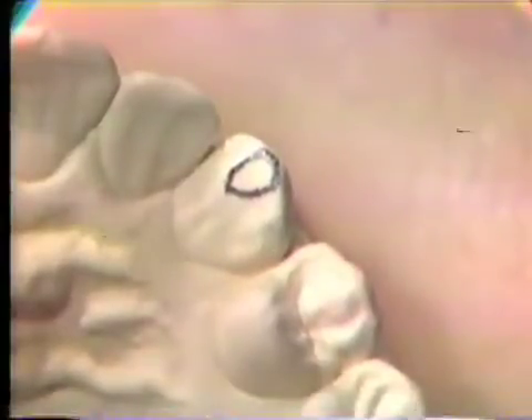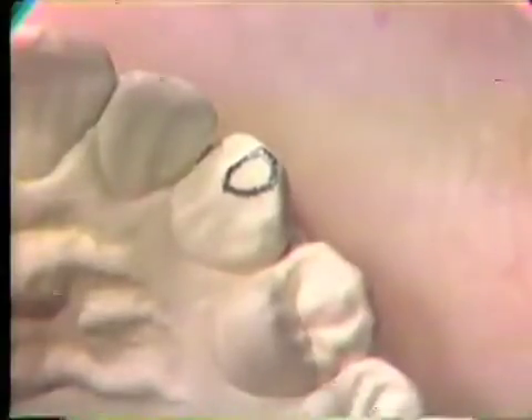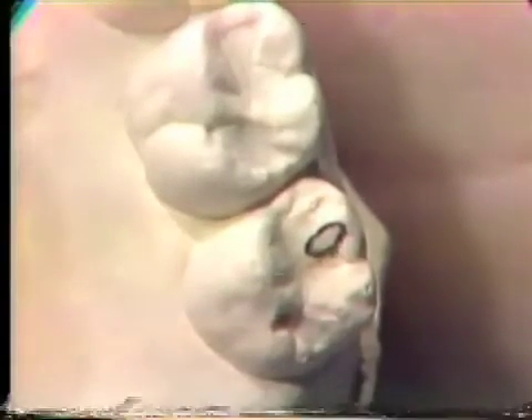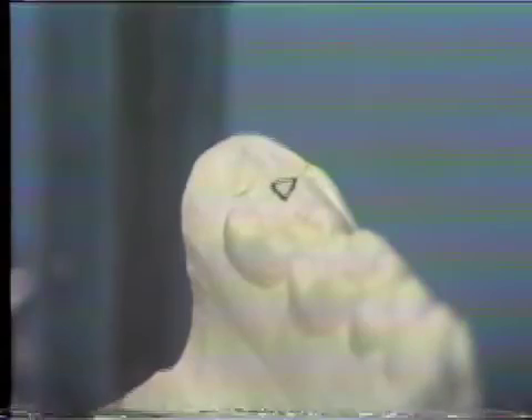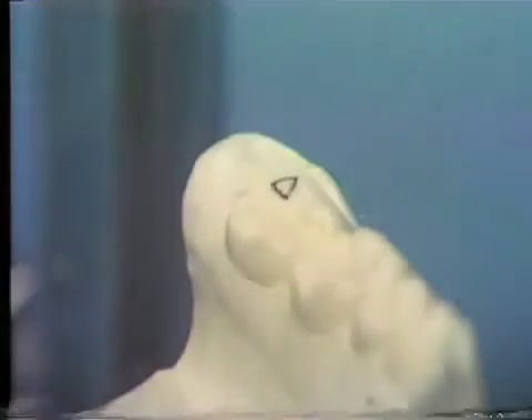Wear facets are the historical record of a person's occlusion. All the teeth should be examined for wear facets before starting the functional waxing exercise. The facet on the maxillary left cuspid is formed by the mandibular left cuspid during the left working excursion. The left working guidance should remain on this cuspid wear facet when the functional waxing is completed. The wear facet on the maxillary left second molar is formed upon closure into centric occlusion. The wear facet on the mandibular left second molar is a balancing side contact, formed by the mesiolingual cusp of the maxillary left second molar during a right working excursion.